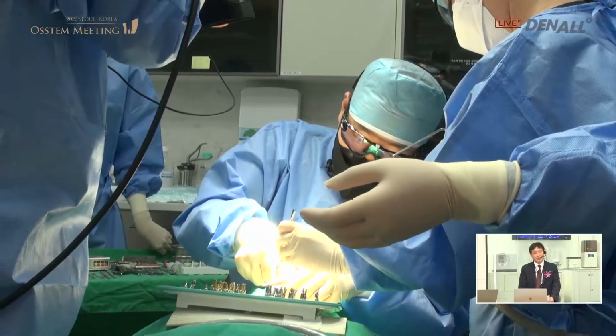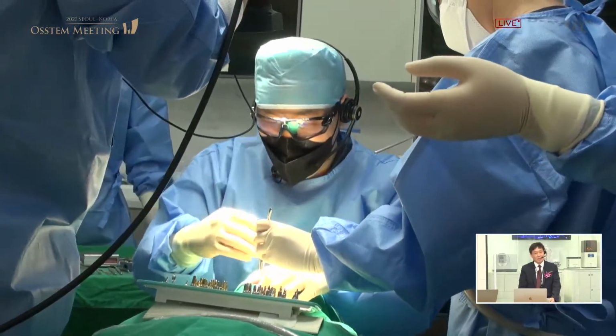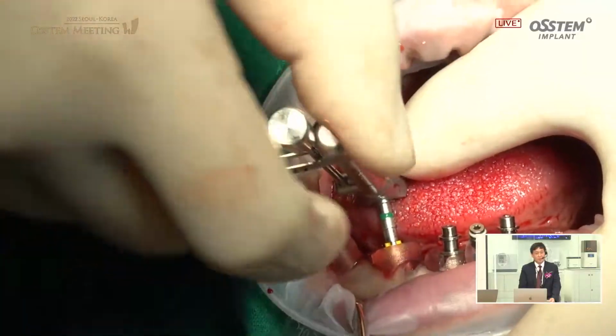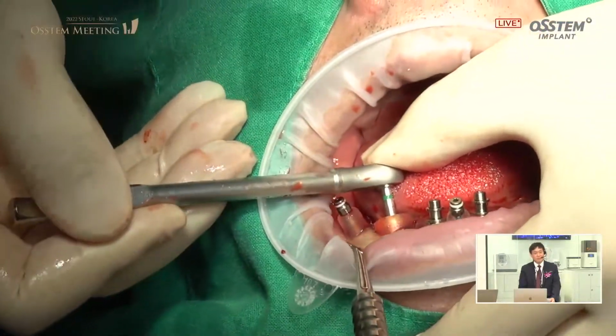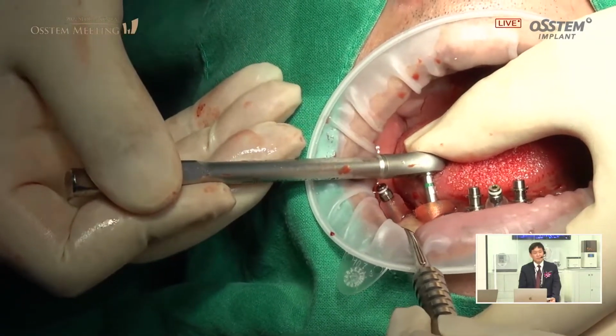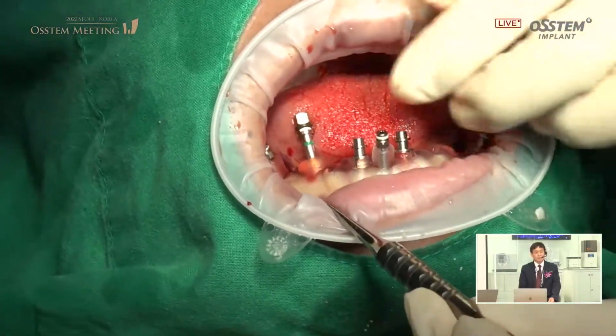Because in the lower jaw we are going to provide an immediate provisional restoration, if you look over here, it's over 30 Newton. So primary stability today is good. It's not stuck, so it's going nicely.